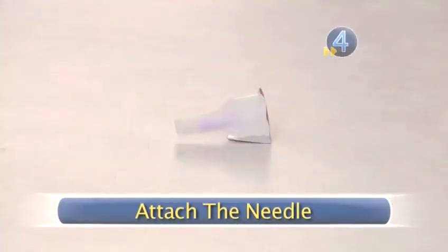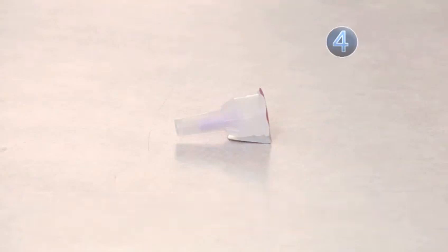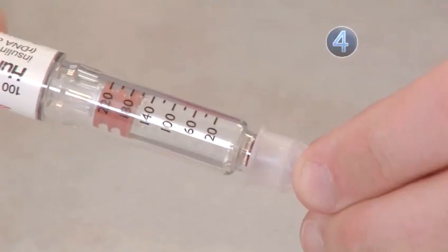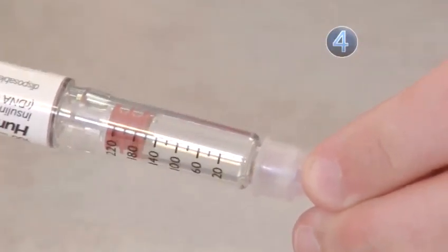Step 4. Attach the needle. Always use a new needle for each injection. Remove the protective paper tab from the outer needle shield and attach the shielded needle straight onto the pen. Save the shields for when you detach the needle.